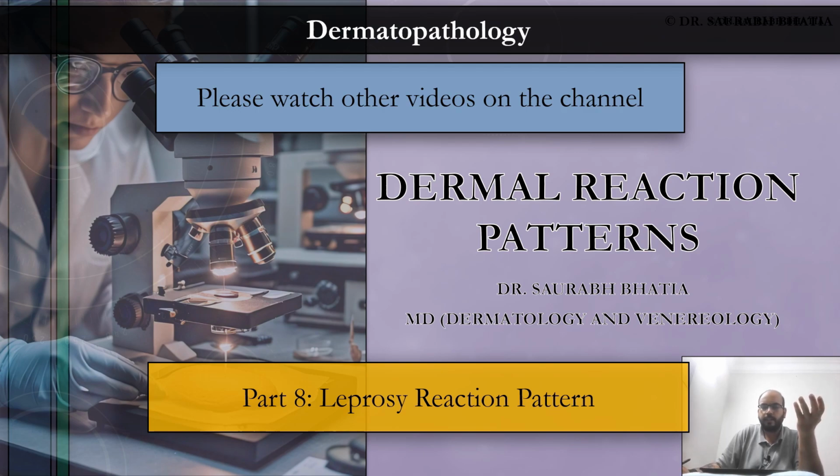And in most of the books, leprosy reaction pattern is covered in granulomatous tissue reaction pattern because that's what are there in leprosy. We have granulomas. But treating this reaction pattern separate from other reaction patterns makes it easier to understand the histopathology and the pathology of leprosy.